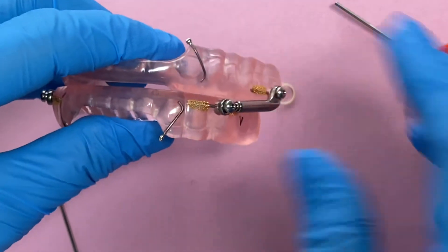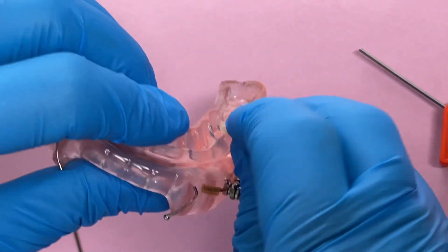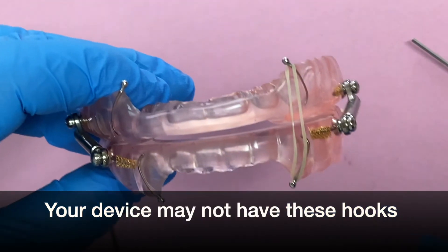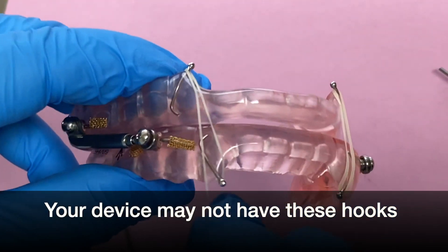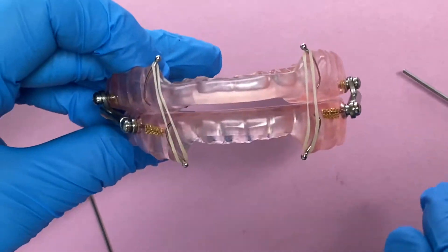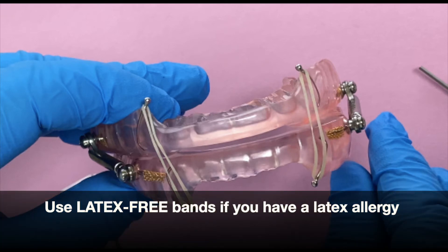Now one last thing I'd like to address is attaching elastics. I don't recommend for my patients that they use elastics the first couple of weeks of wearing their device. There's another video where we talk about when it's a great idea to use elastics, but for now I just want to do a quick demo — if your mouth is kept open or dried out, these sometimes help the mouth stay closed more. Attach them to both sides and change them about once a week. If you have a latex allergy, definitely make sure you have latex-free elastics.